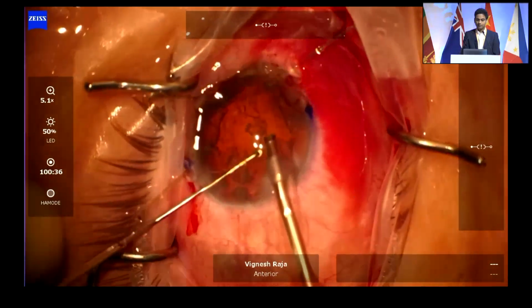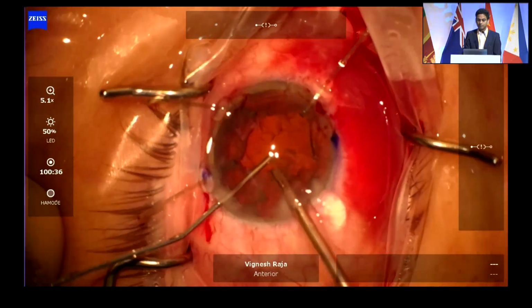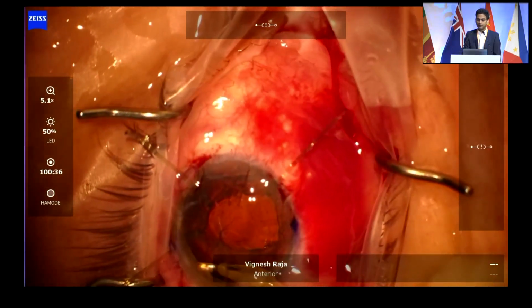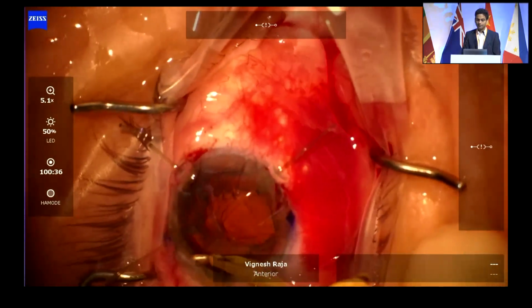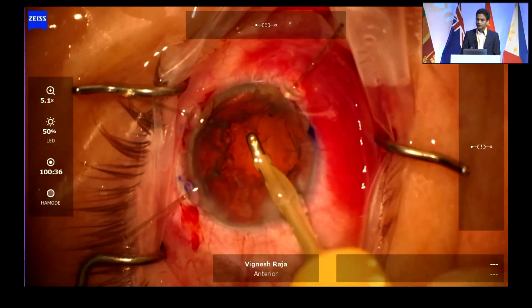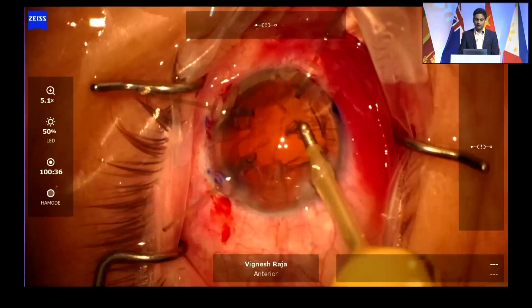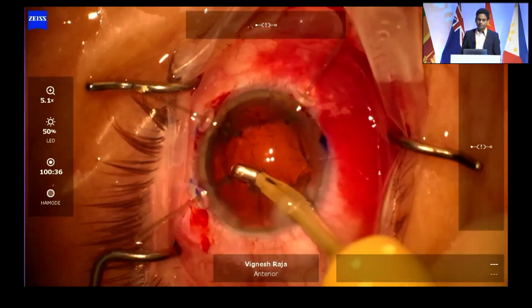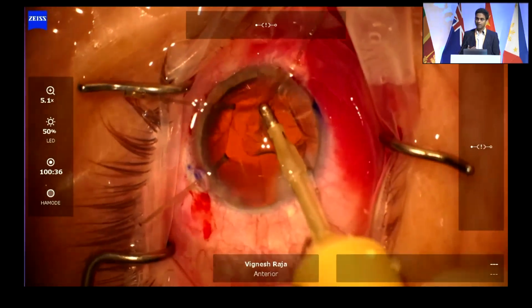And always be careful with the last piece, like how Sunil and Dr. Minumathan showed. That's when you get post-occlusion surge, and then already the whole apparatus is floppy, then it can come out. So now do IA with tangential sweeps rather than radially stripping. And these capsule hooks provide very good equatorial support. So you can get through the step very nicely, doing it in a very gentle and careful manner.